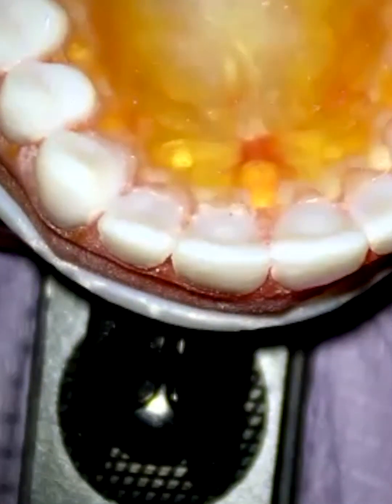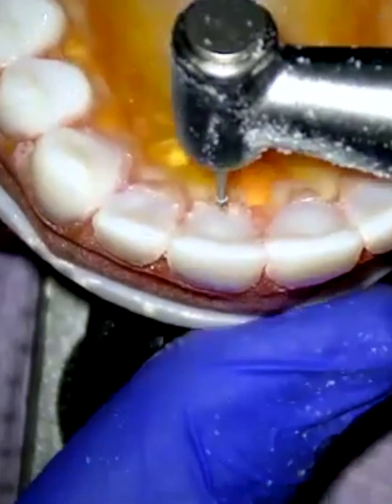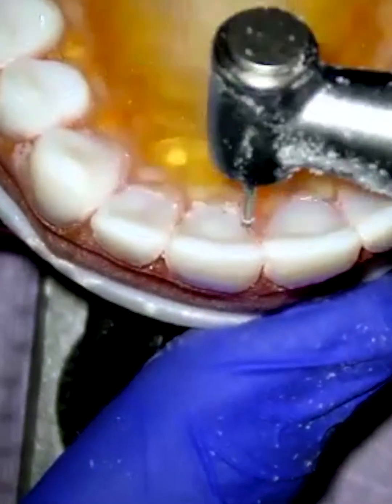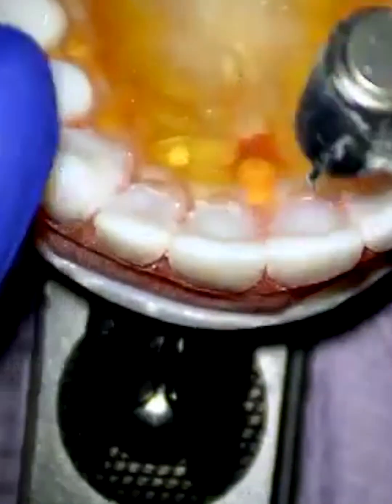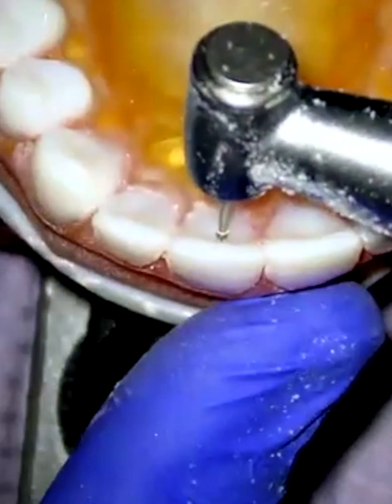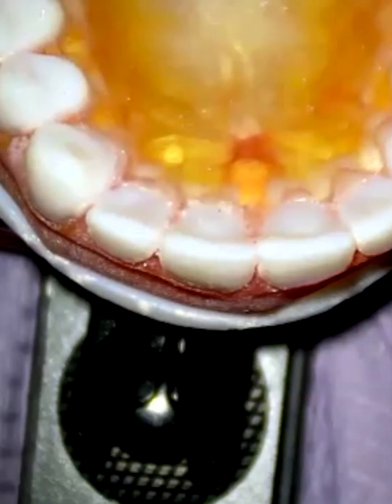What I'm trying to express is that before you start — before the rubber dam, which is the first thing we learned in dental school, right, put the rubber dam on — if I just come to the area, my foot is nowhere near the gas, and I just study it and look at what it should look like, I see the neighbors. They help me with the alignment. Then when I put the rubber dam back on, the picture seems a lot clearer.